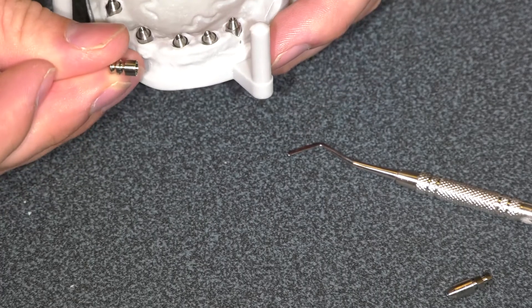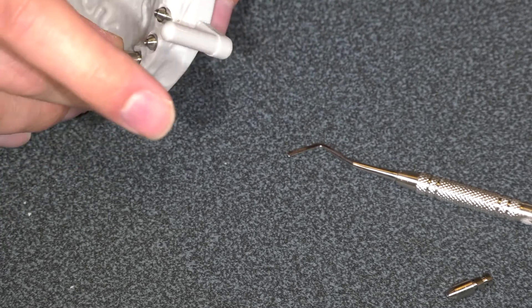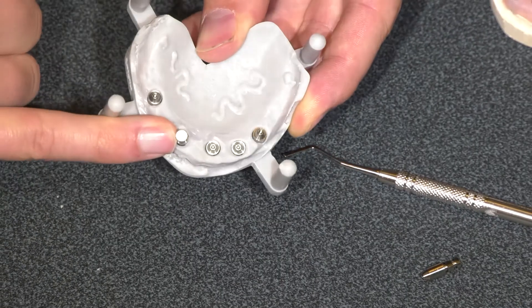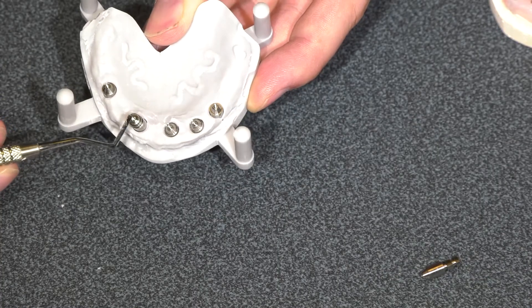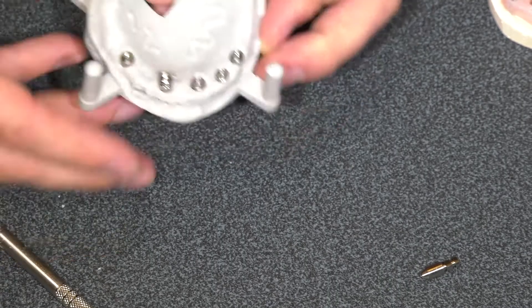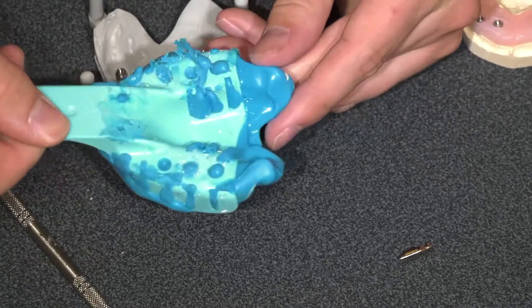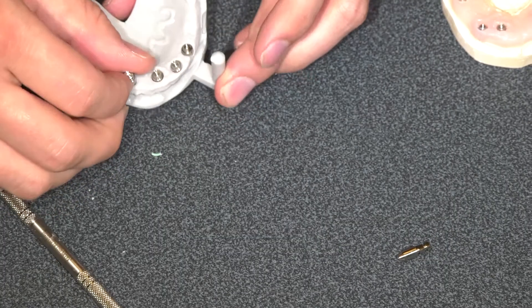In my hand here I have a closed tray multi-unit impression coping. This simply screws down onto our multi-unit. It does have an 050 driver that's available to put this in, or you can finger tighten. We're going to do this for all the multi-units in the arch. Next we're going to take our impression. This impression has been taken with those closed tray copings — you can see it's not sticking through the impression, so it's not open tray, it's closed tray. What you're going to do then is take these back out of the patient's mouth.